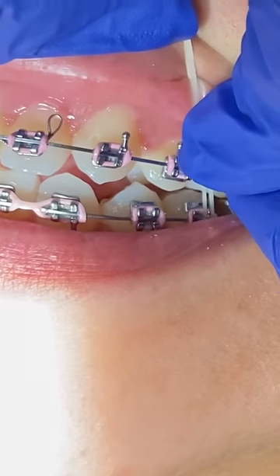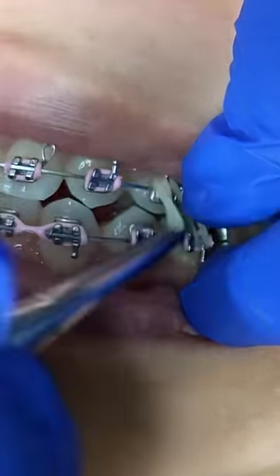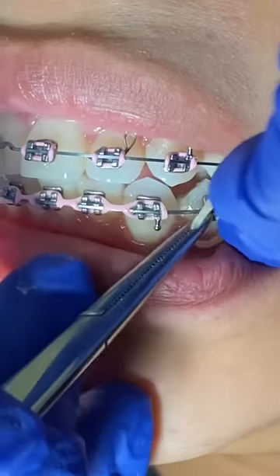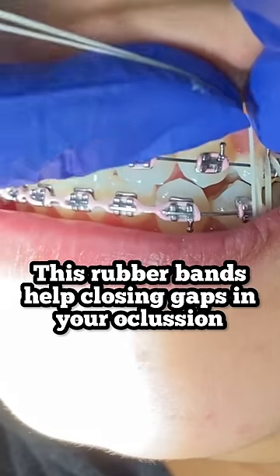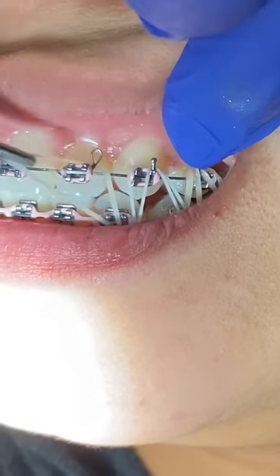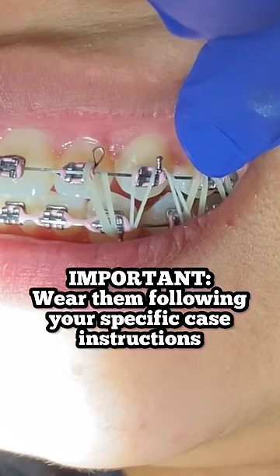The orthodontic assistant or dentist will go ahead and give you some tools to help you apply these rubber bands. Sometimes, since it's a little bit more difficult to reach those back areas, these rubber bands help in closing the occlusion of your teeth, mostly on the left and right side.